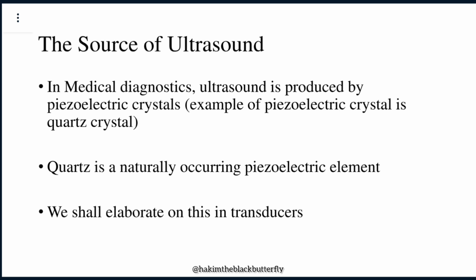Transducer, I think, is not a new word to you. There are so many examples of transducers. An example is a microphone. When you speak on a microphone, you give this microphone mechanical energy, which is sound. Sound is a mechanical energy. And then this microphone will convert that mechanical energy into electrical energy. So that is a transducer. A loudspeaker is a transducer because it converts electrical energy into mechanical energy, which is sound that we can hear.